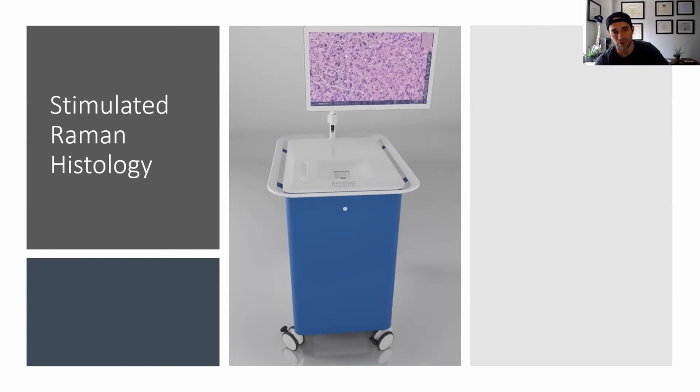But the computer will tell you, it'll say 90% meningioma, 80% GBM. It's a ratio, it's a proportion, basically. It's telling you, I'm 90% sure this is a GBM. So within 2 minutes, you get an accurate diagnosis in the operating room rather than waiting 20 minutes outside or 30 minutes, all right? Or if there's something unclear, even longer. So, this is another area where we've really pushed the envelope. Pathologists, I think, are a little bit scared of it, but it's okay.